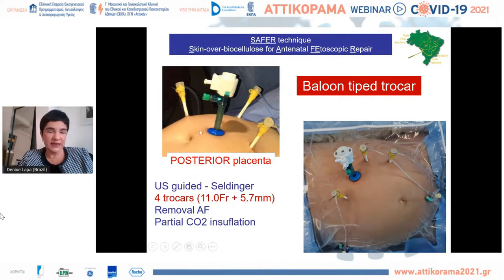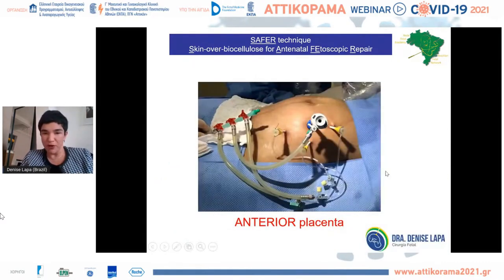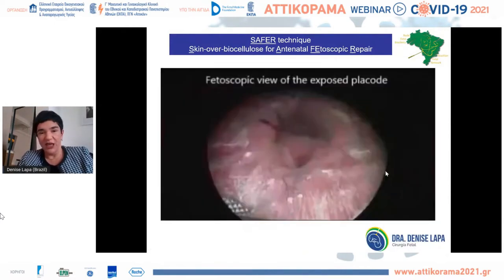With a posterior placenta, you have the normal setting, but when you have an anterior placenta, you have to deal with what you have. And I have to say that in the past 10 cases or so, I went back to three trocars, and we are using only this one that I could not get rid of, but maybe I will. I've been challenged by the professor for a long time to do it, so I'm trying now.